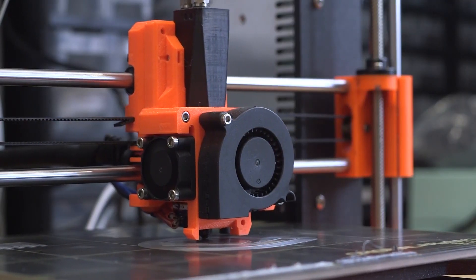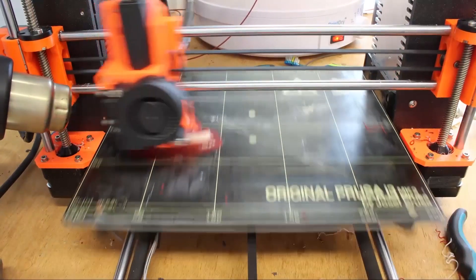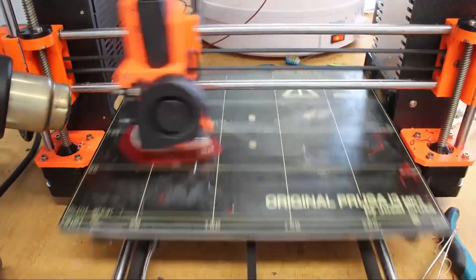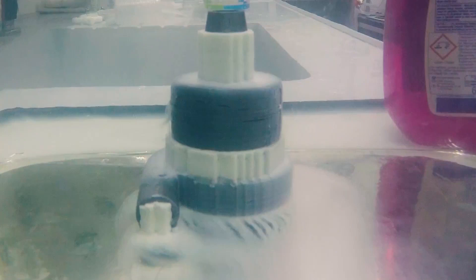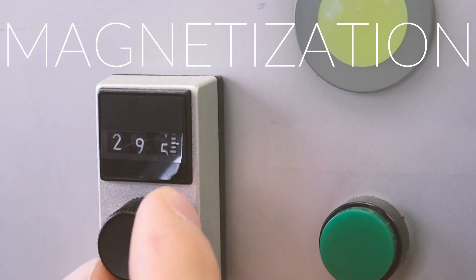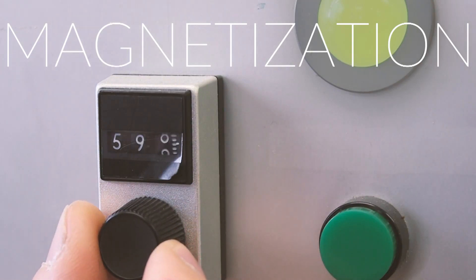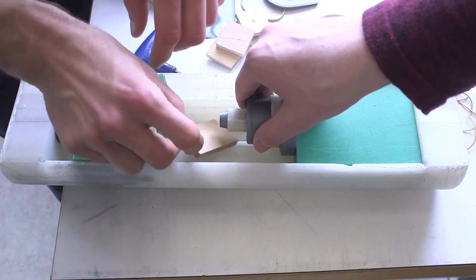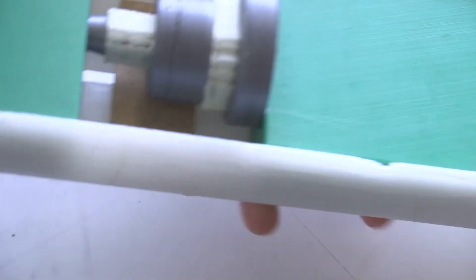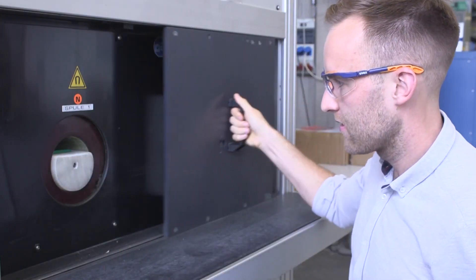The printing process is done on a conventional FDM printer with multiple extruders. We slice the model, and then in each layer the printer changes the filaments to print different materials in different areas. To support overhangs or to fill gaps, we use a water-soluble material that will be removed after the print. The final step is to magnetize the part in a strong magnetic field. This is necessary because the powder that we use is isotropic, meaning that there is no overall magnetic polarization to it.